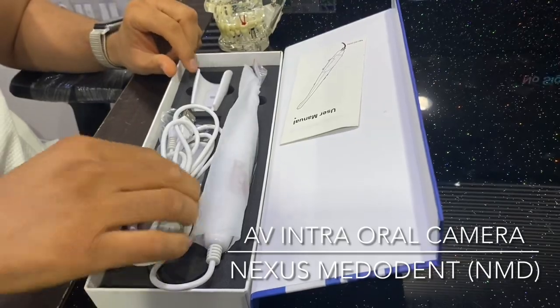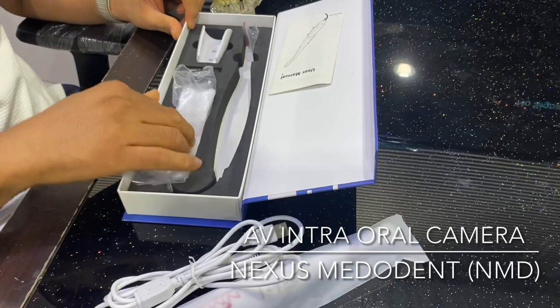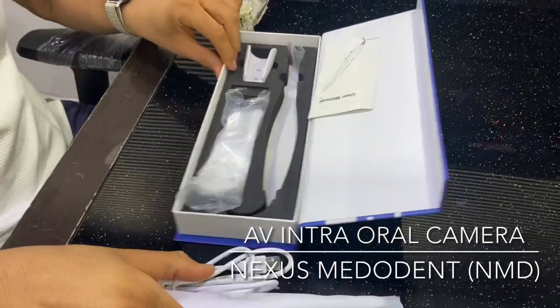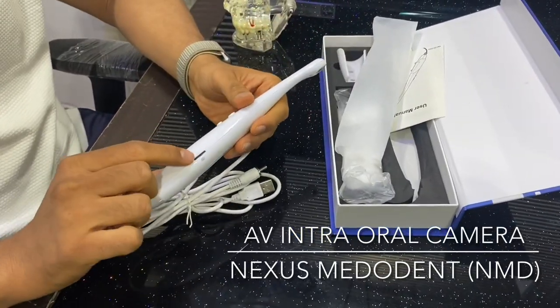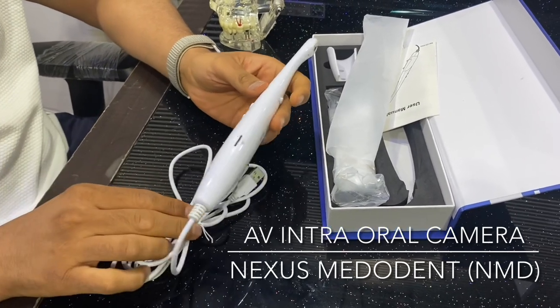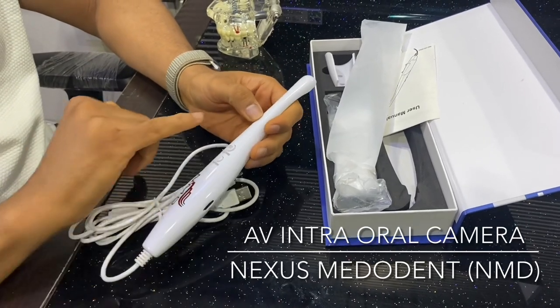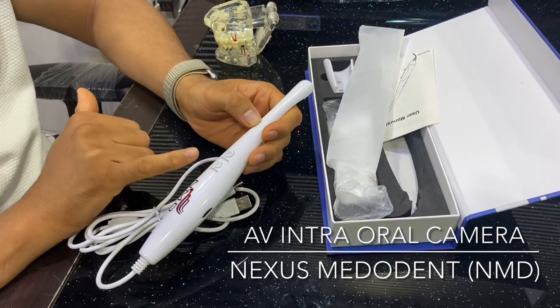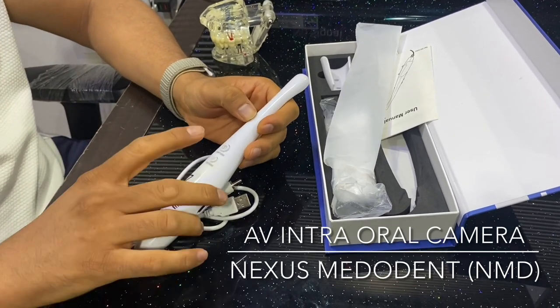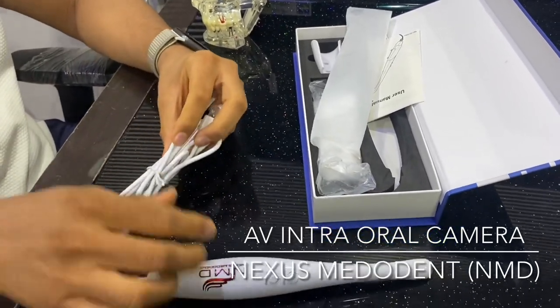Let's unbox it. We have a user manual, the camera itself, some free sleeves, the camera holder, and an SD card reader. The camera comes with a free 8 GB SD card which can also be upgraded. The buttons: this is the on/off button, this is the capture button, and this is the picture button — by pressing the picture button, whatever pictures are stored on your SD card can be directly viewed on the TV.